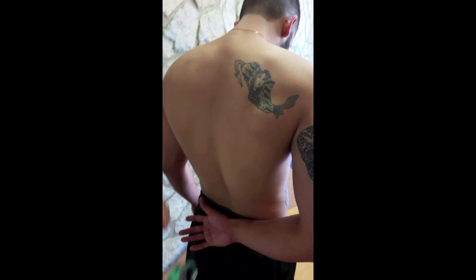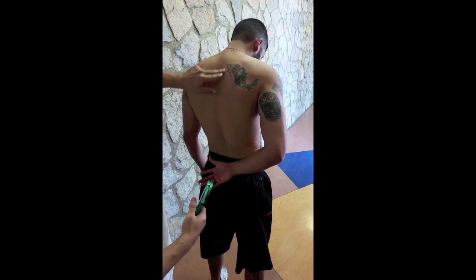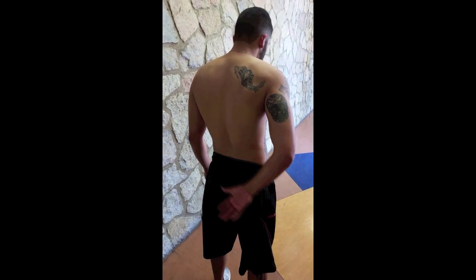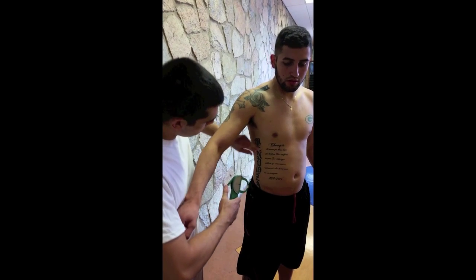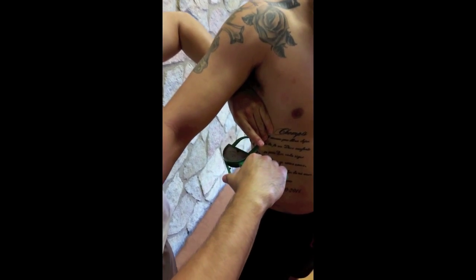If you have a participant who is obese or overweight, what might help the skin fold measurement would be asking your participant to bring their arm back. You will measure the mid-axillary skin fold site using the vertical fold at the level of the xiphoid process of the sternum.